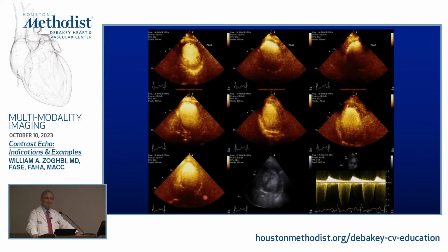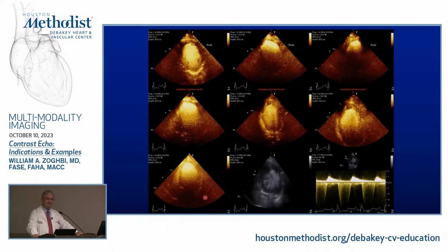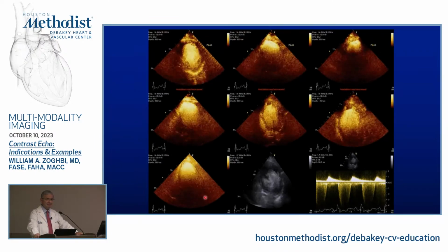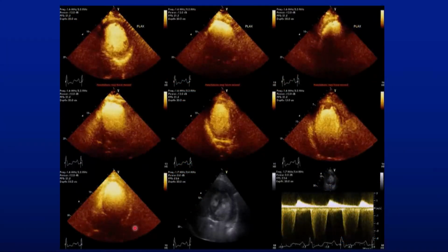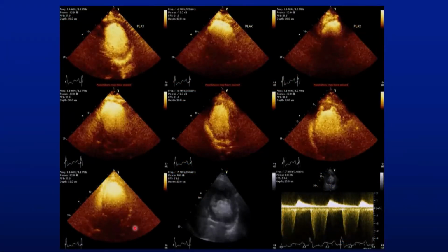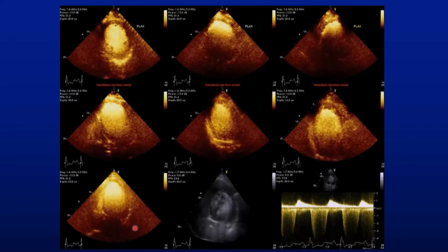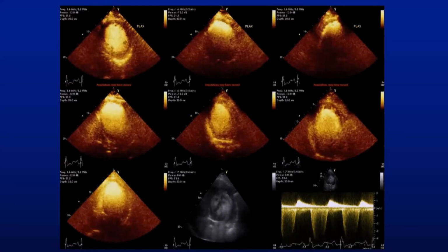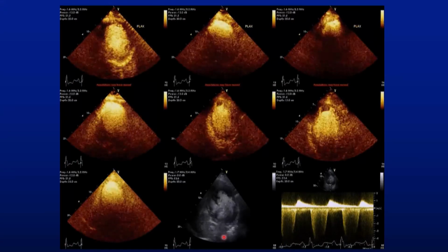I think here there is probably a little contrast. We need more contrast in this. Or I think there is slow flow, so some of the bubbles are getting destroyed. That's the same patient. I don't know when this was taken. I think they went up on MI. They went up on the mechanical index. They followed your advice, Dr. Toro. They sure did, and notice that the contrast in the atrium is very decent, right?